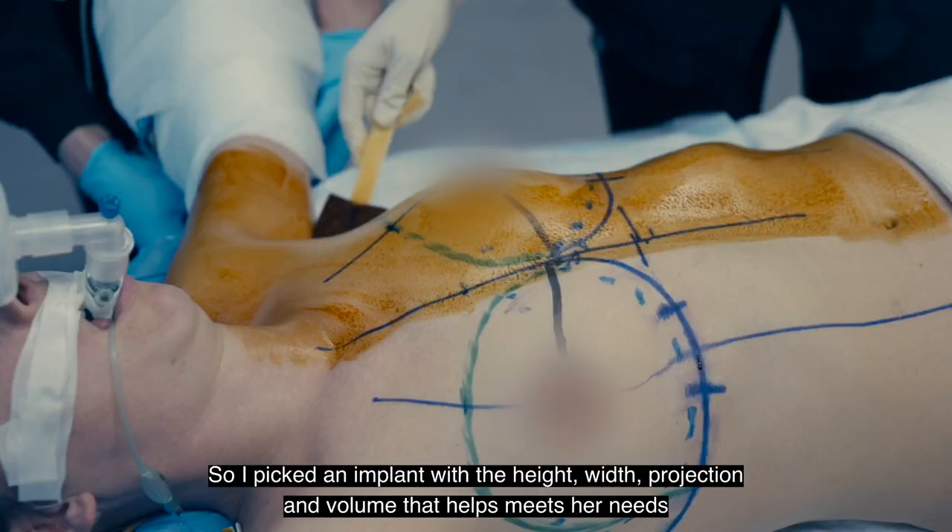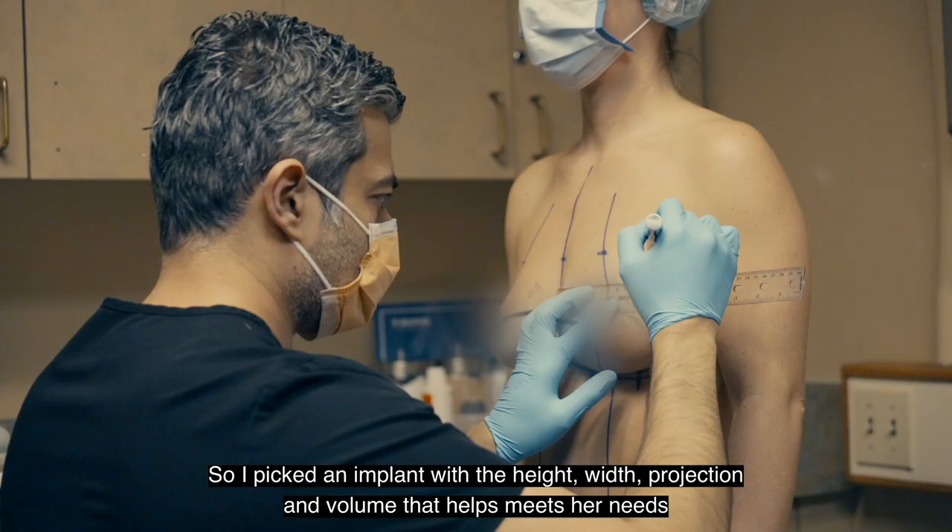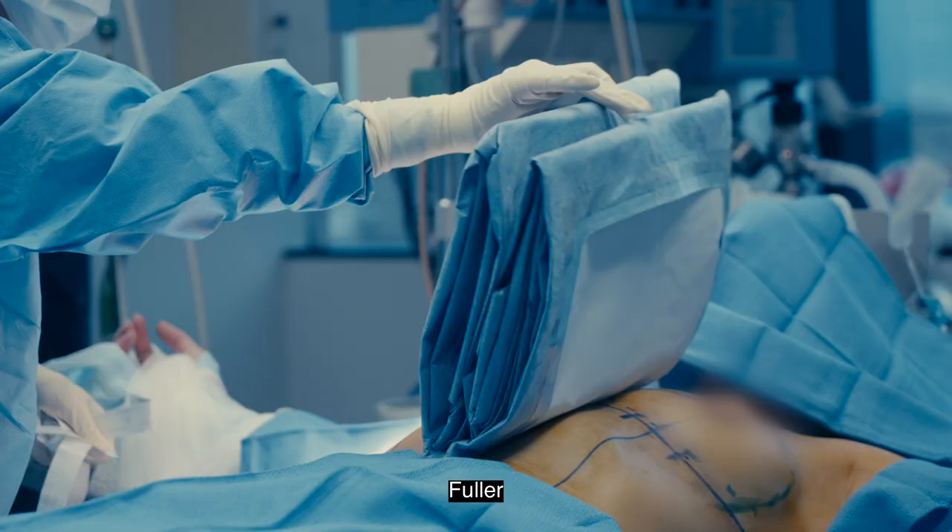I picked an implant with a height, width, projection, and volume that helps meet her needs. Her goal was to be bigger, fuller, and perkier.